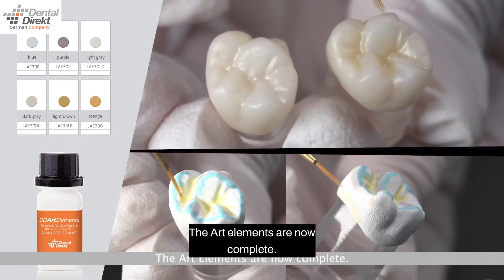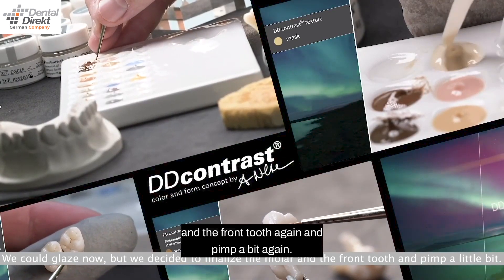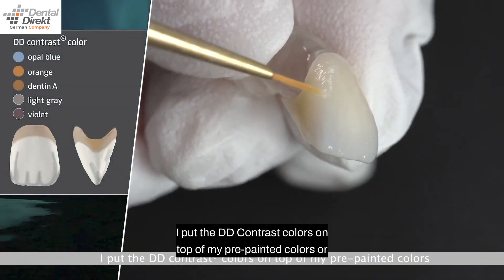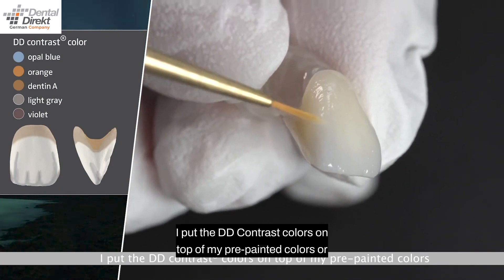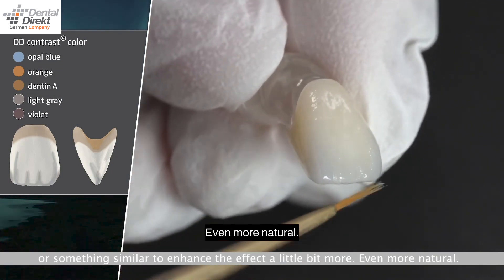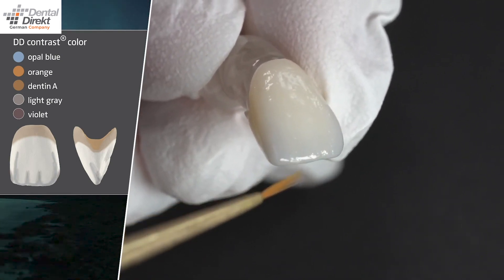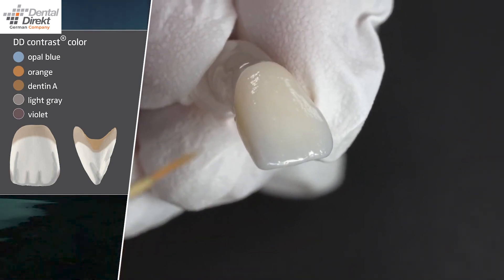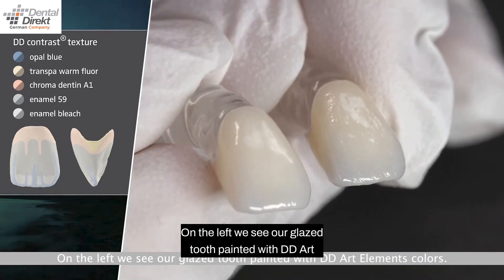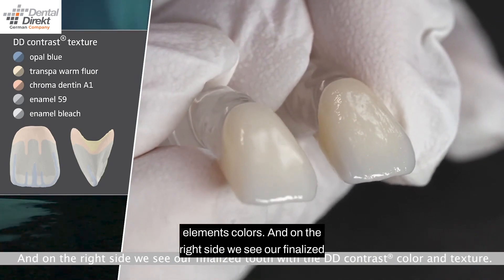The art elements are now complete — we could glaze now. But we decided to finalize the molars and the front tooth and pimp them a bit more. I put the DD Contrast Colors on top of my pre-painted colors to enhance the effect a little bit more, making it even more natural. On the left we see our glazed tooth painted with DD Art Elements colors, and on the right side we see our finalized tooth with the DD Contrast Color and texture.